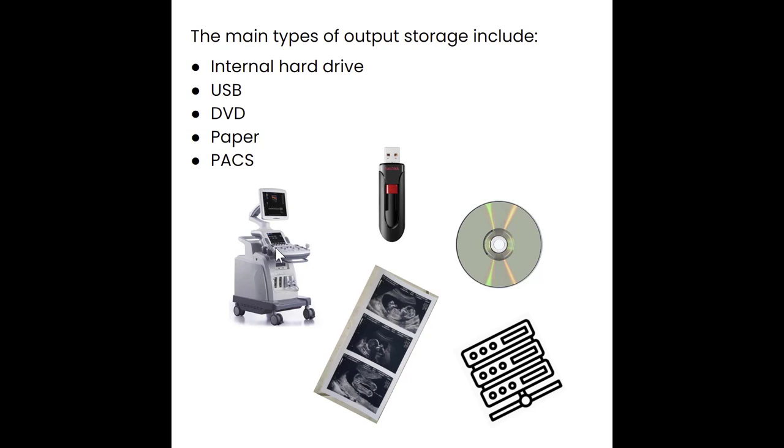After you end the image and it's saved onto the hard drive on the machine, most hospital and clinic systems are going to send those images directly over to PACS. We're going to talk about PACS a little bit more in detail in a second. PACS is a large server on which all of those images are going to be stored.